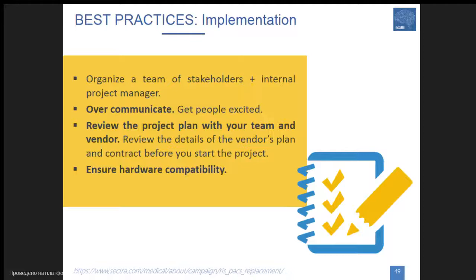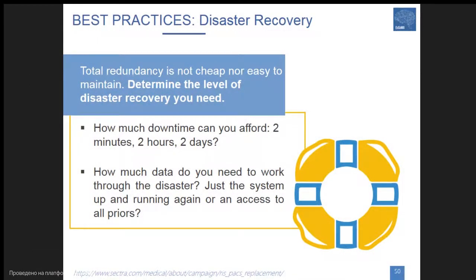The plan of the project should be reviewed with the team and the vendor, and the hardware compatibility should also be ensured beforehand. Best practice for disaster recovery means that you should define the level of needed disaster recovery. How much downtime can you afford? 2 minutes, 2 hours, or 2 days? It depends on the clinical services, the type of the hospital, the type of the medical center. If it is an emergency service, then 2 minutes of downtime might not be affordable.